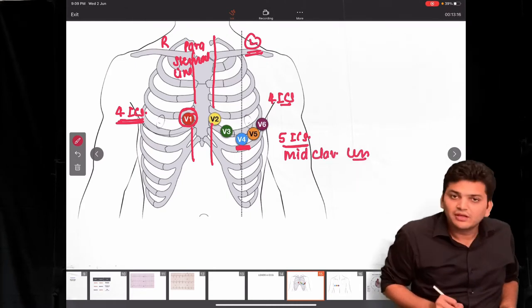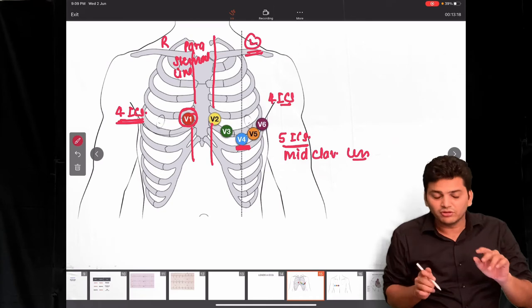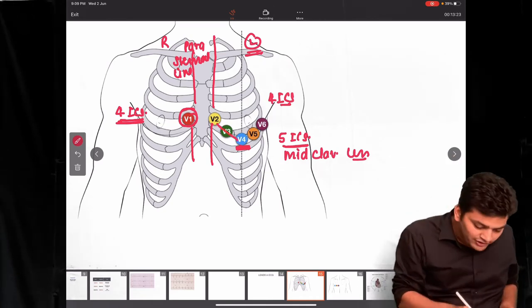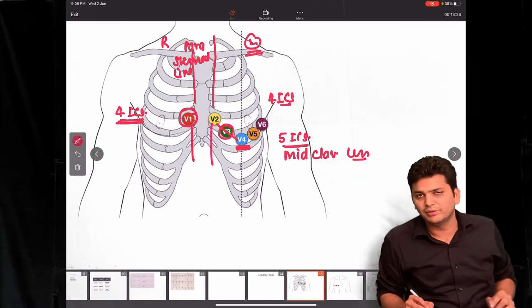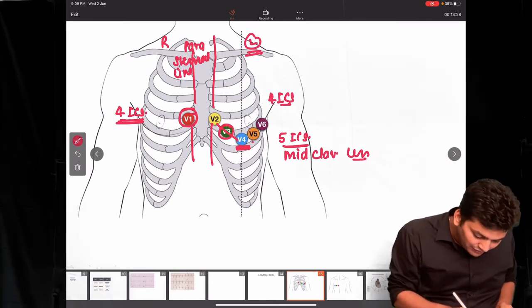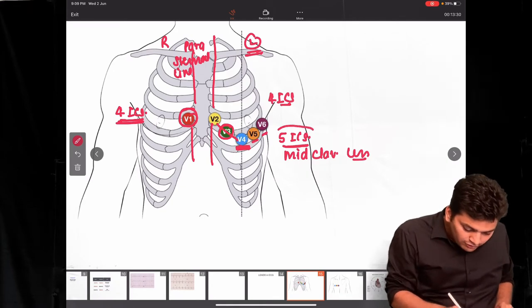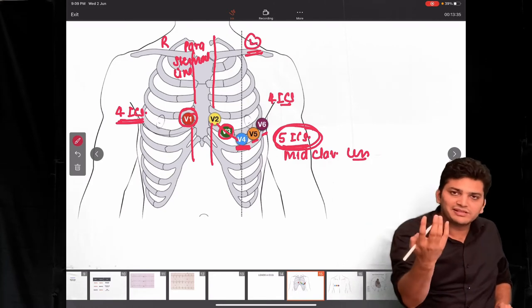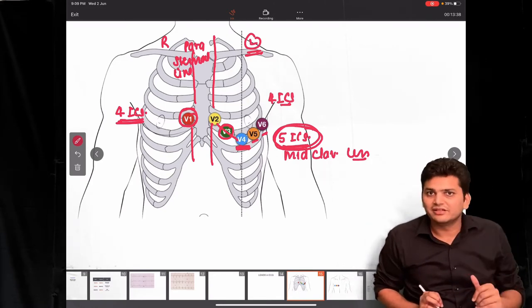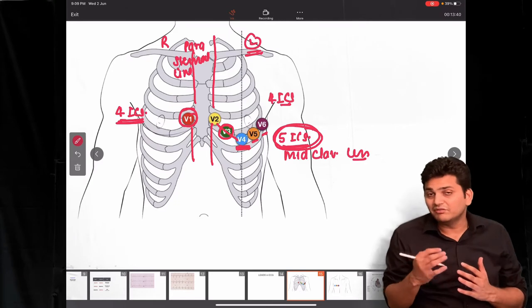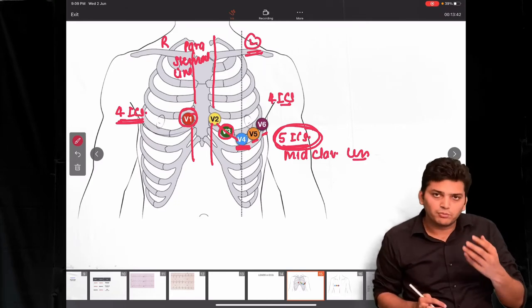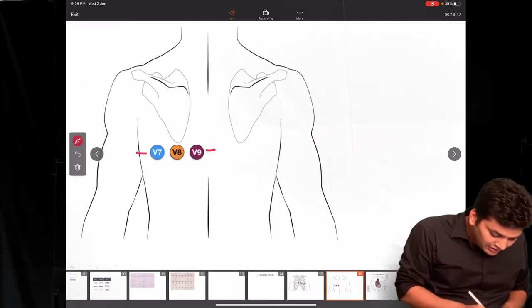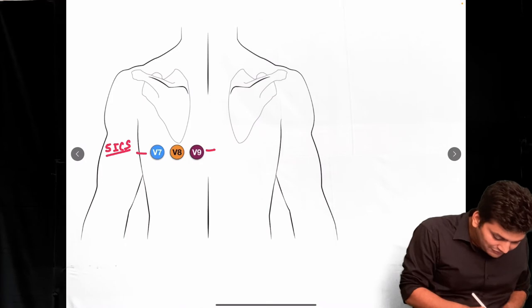Once V4 is placed, V3 goes in the midway between V2 and V4. Then V5 and V6 are placed in the fifth intercostal space along the anterior axillary line and mid-axillary line respectively. If placing the posterior leads V7, V8, and V9 — used for detecting posterior wall MI — they are placed in the fifth intercostal space on the left side.